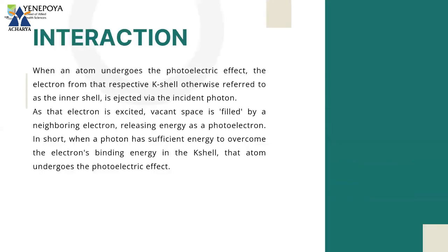As you all know, X-ray photons primarily interact with matter via the photoelectric effect and Compton scattering at the diagnostic radiology level. When an atom undergoes the photoelectric effect, the electron from the K shell, the innermost shell, is ejected by the incident photon.